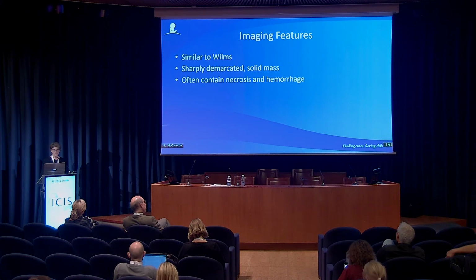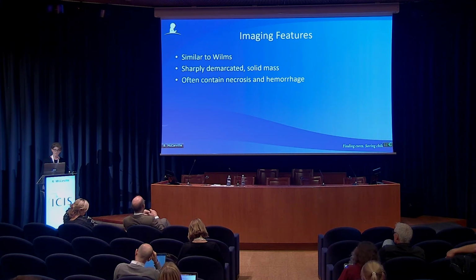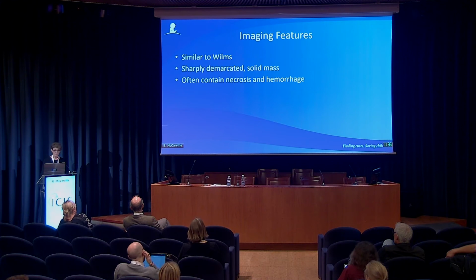On imaging, there's really no imaging feature that can tip you off that you're looking at a clear cell sarcoma. They look just like Wilms tumor. So if I see something that looks like a Wilms tumor in a very young patient, I usually include clear cell sarcoma in my differential.